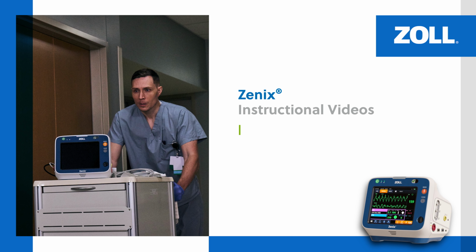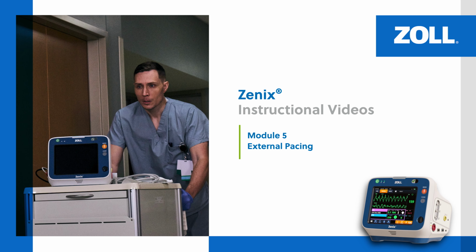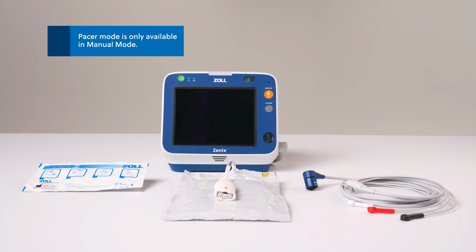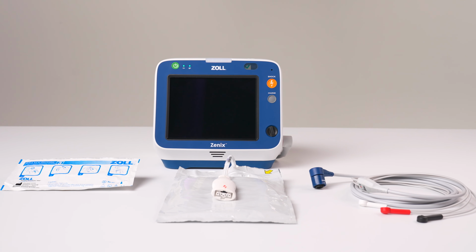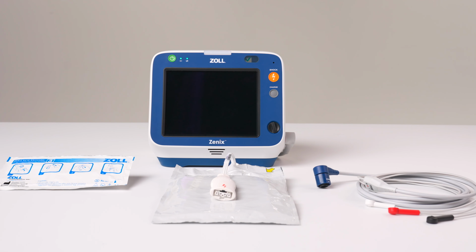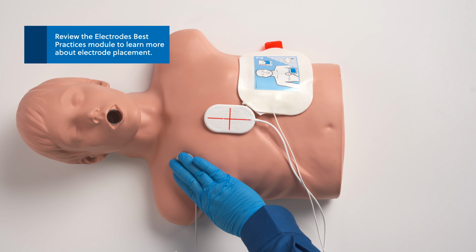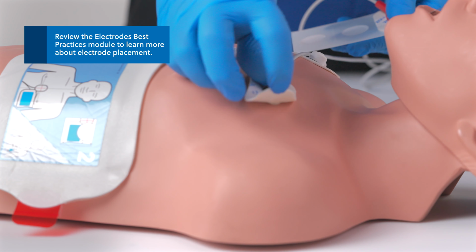In this video, we review the external pacing features of the Zenix Monitor Defibrillator. Zenix can provide demand or fixed pacing. This module focuses on demand pacing using Zenix CPR electrodes. To initiate external pacing, place both the 3-lead ECG and therapy electrodes on the patient and ensure they are connected to the device.